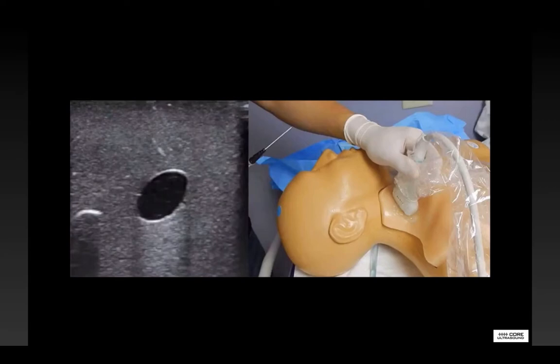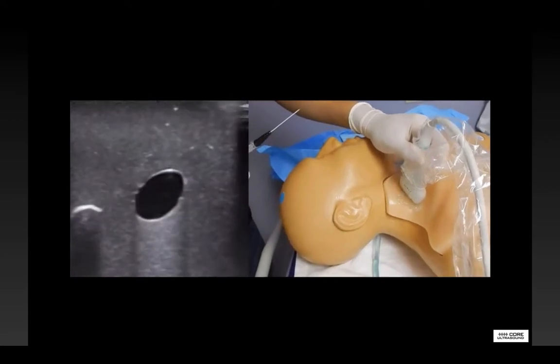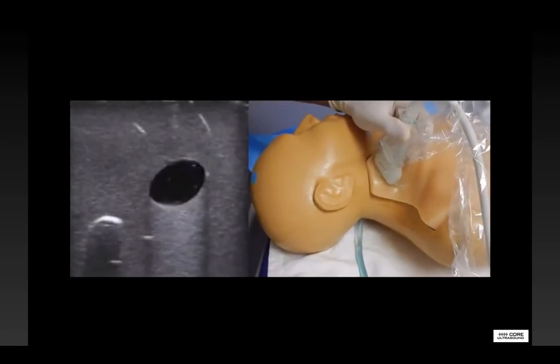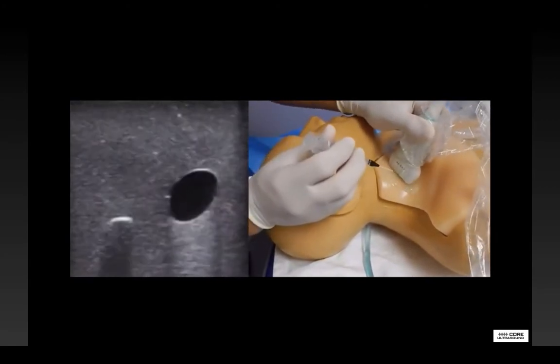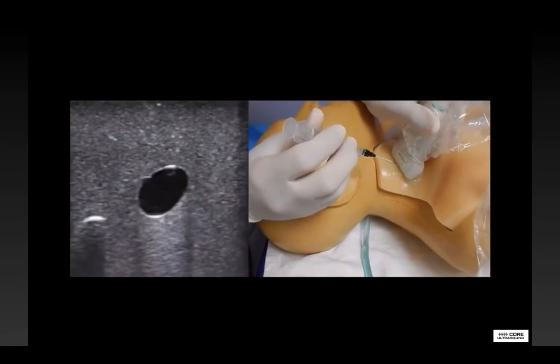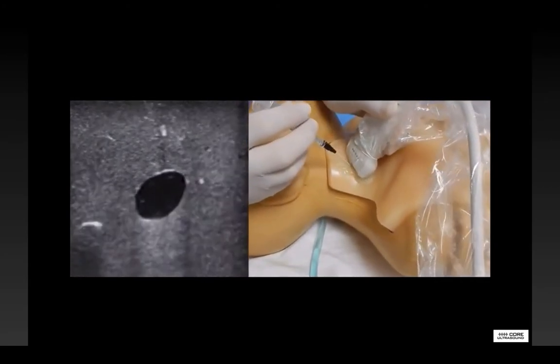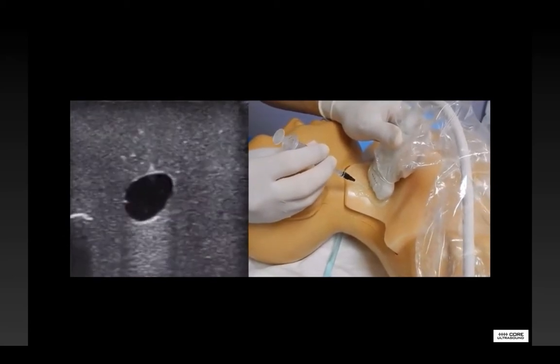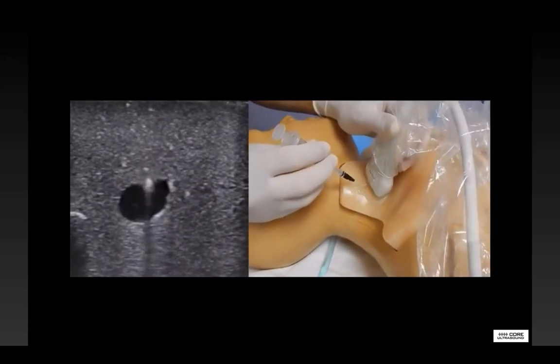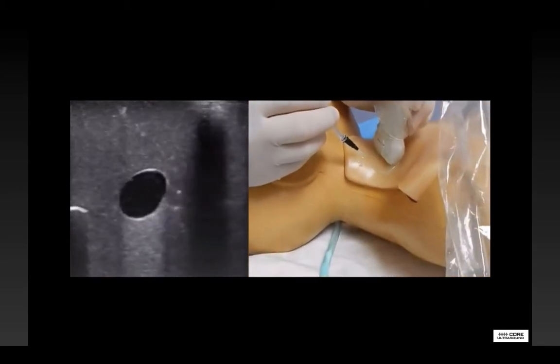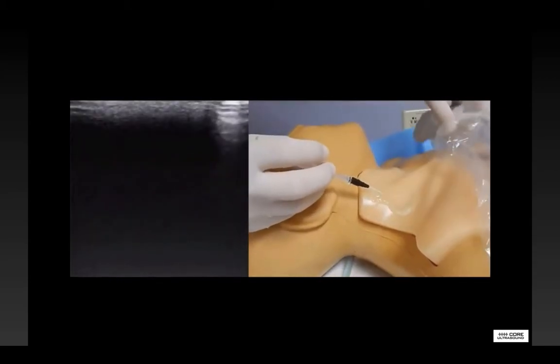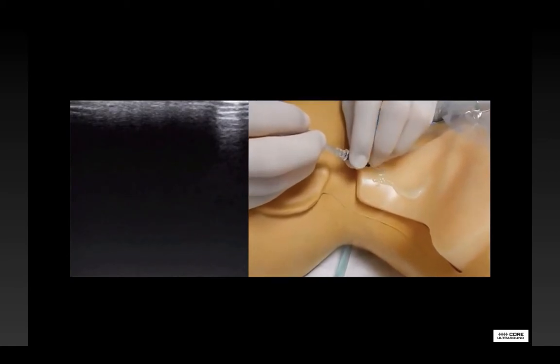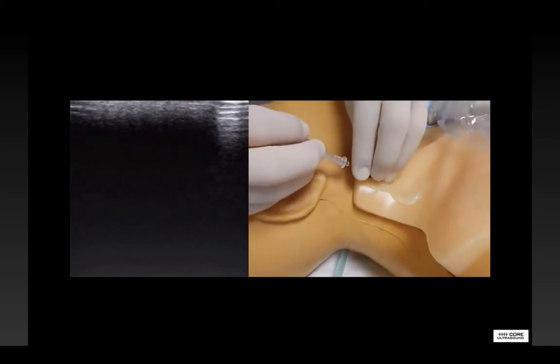Here, we'll watch an example of an out-of-plane approach on the right internal jugular vein. You'll see the provider has a catheter over a needle, and he follows the tip of the needle through the soft tissues down into the vessel lumen. Once in position, he removes the needle and advances the catheter.